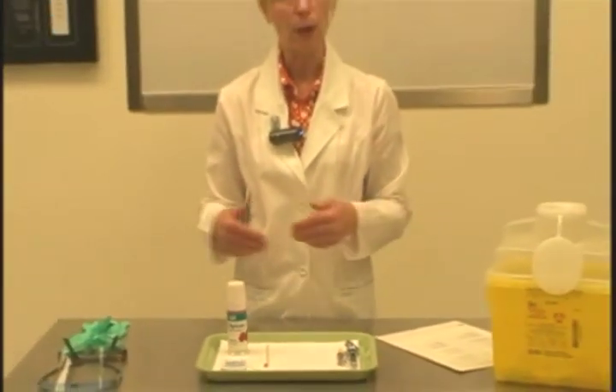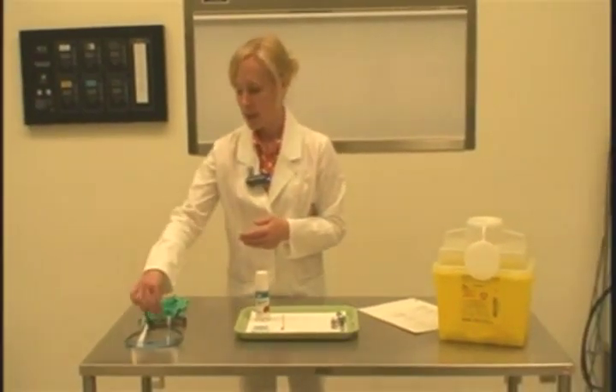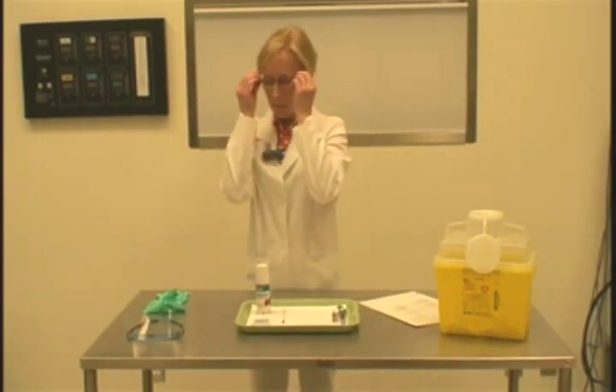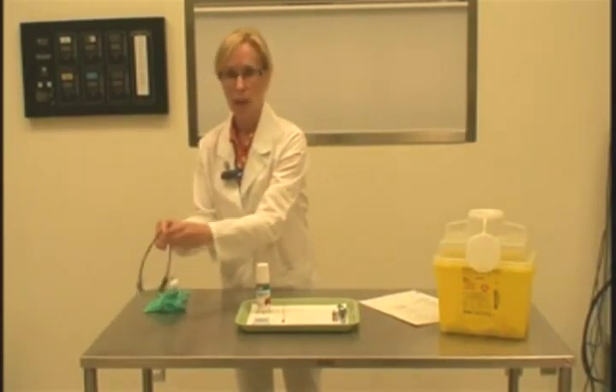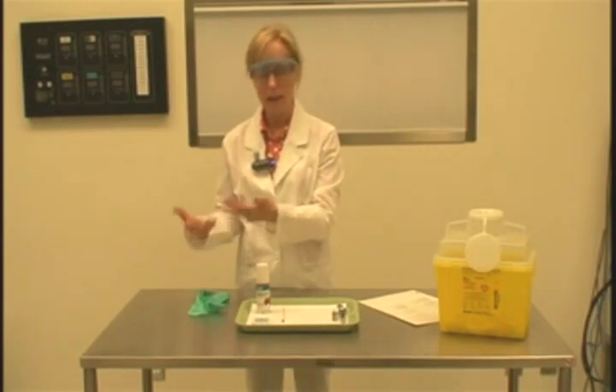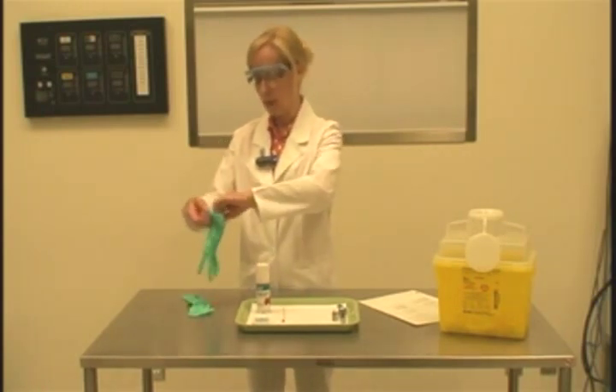Now we're ready to put our protective equipment on. The first thing is to position our protective eyewear. For this procedure, we only need our protective eyewear and exam gloves. Prior to positioning my exam gloves, I would wash my hands and then place my exam gloves on.